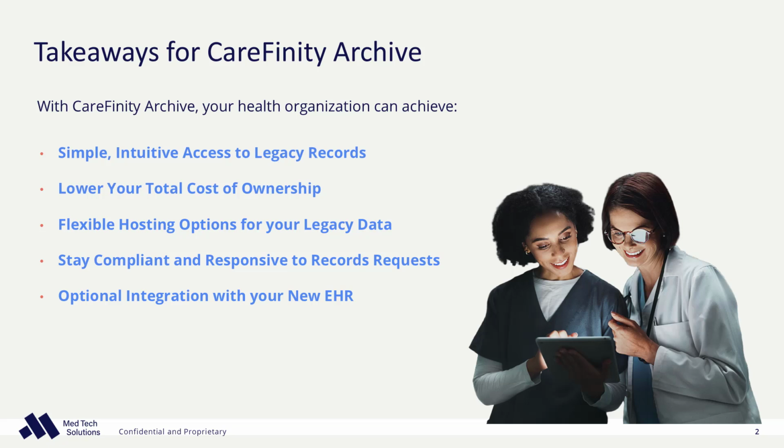Lower your total cost of ownership. Be able to reduce potentially hardware cost and legacy software vendor cost and have a lower cost of ownership, but still retain that access to your data. Flexible hosting options. You can host it. MTS can host it. We can put it in the cloud. You can host it on physical servers. We are flexible when it comes to hosting.